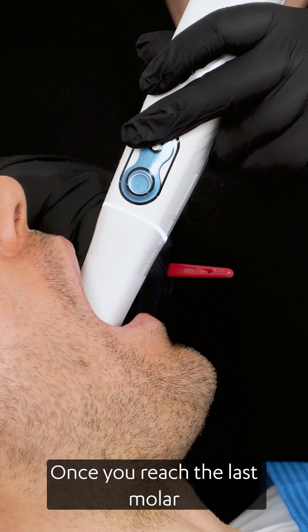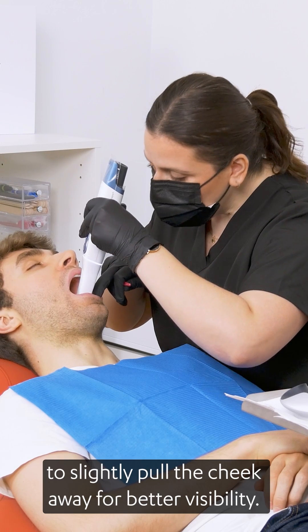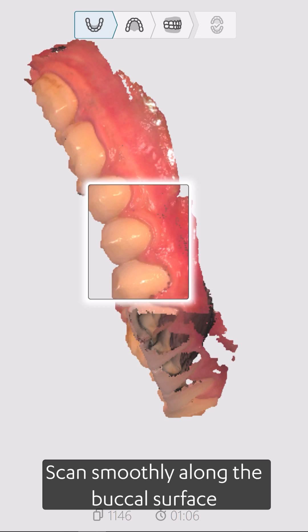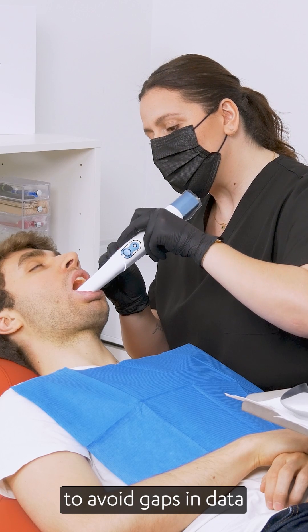Once you reach the last molar on the opposite side, roll the scanner toward the buccal surface. Use your fingers to slightly pull the cheek away for better visibility. Scan smoothly along the buccal surface back toward the starting point. Maintain a slow, steady movement to avoid gaps in data.